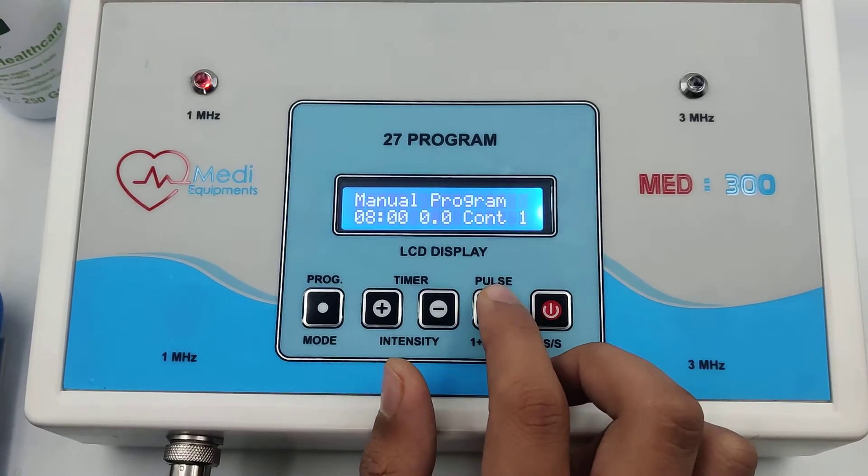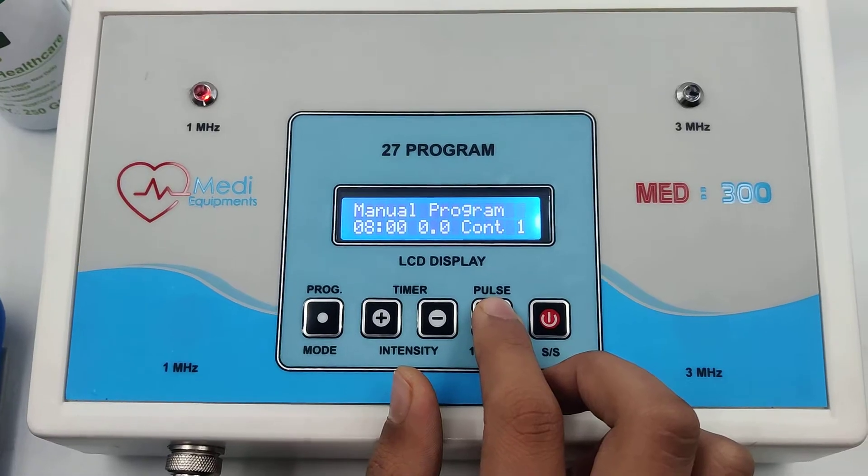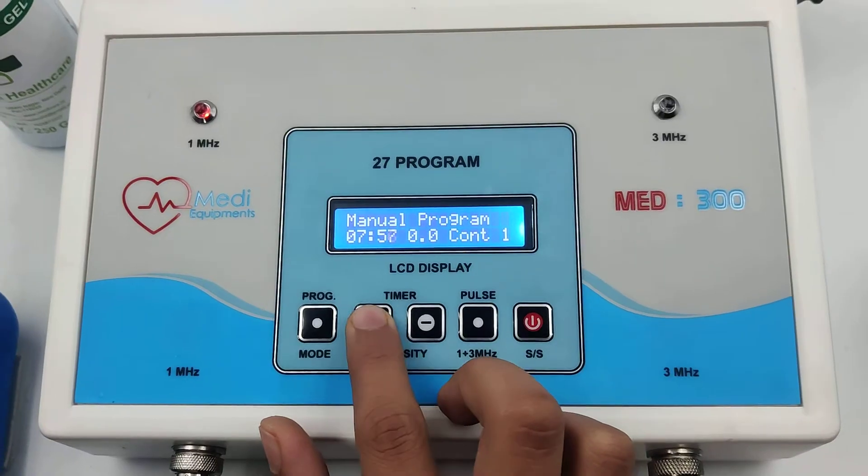In continuous mode, the maximum intensity is 3.5, and in pulse mode the intensity depends on the pulse ratio. Start the machine and increase the intensity as per your need — intensity up.